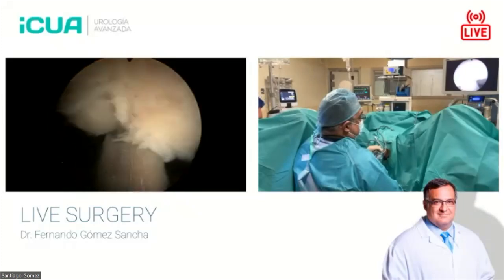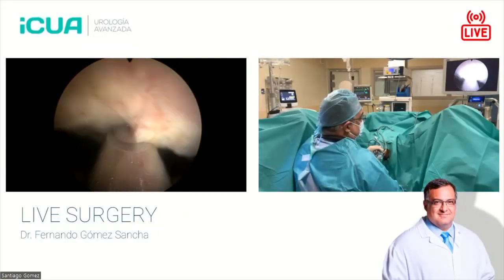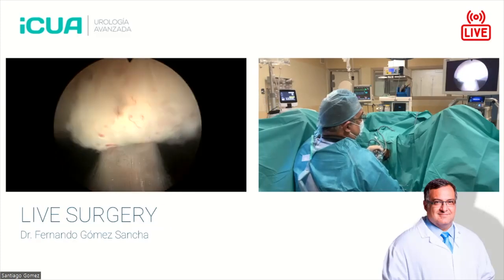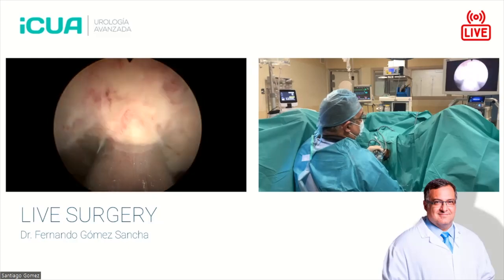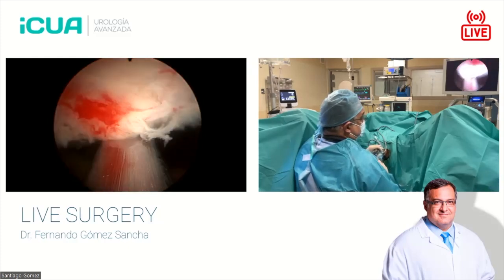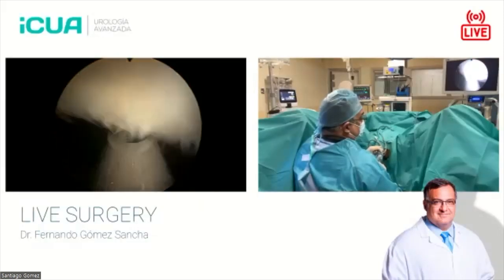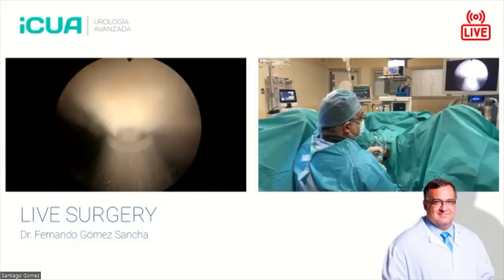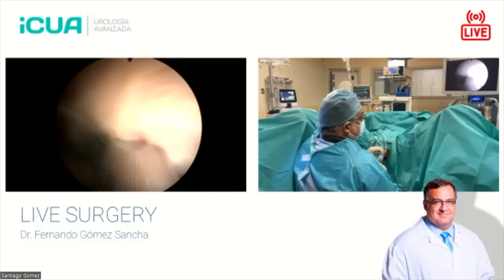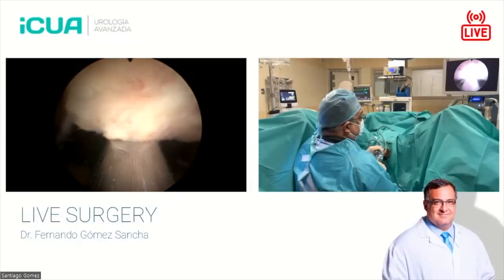And Thomas Hermann has some hypothesis on the stricture, that the bladder is weak, and in patients with a weak bladder, maybe the stricture of the bladder neck can happen more frequently. Yeah, there's no data that I know of about that, so it's probably an opinion. Thomas Hermann is also proposing to leave a little flap of mucosa at 12 o'clock.